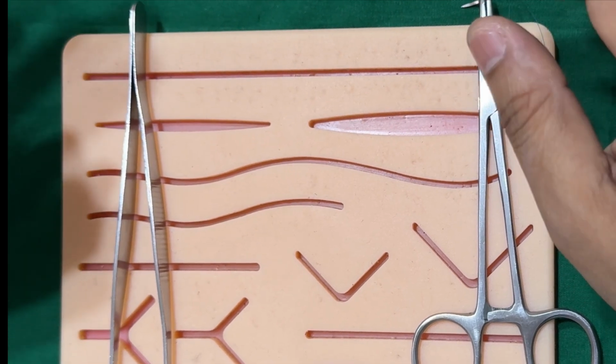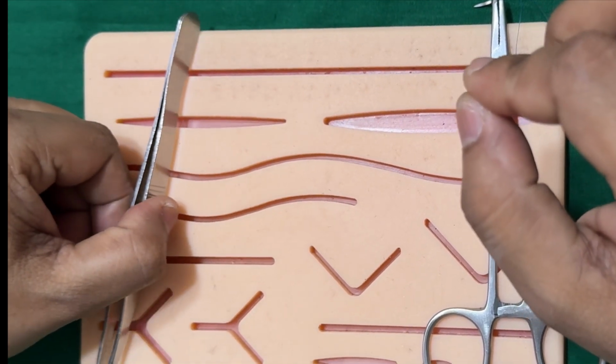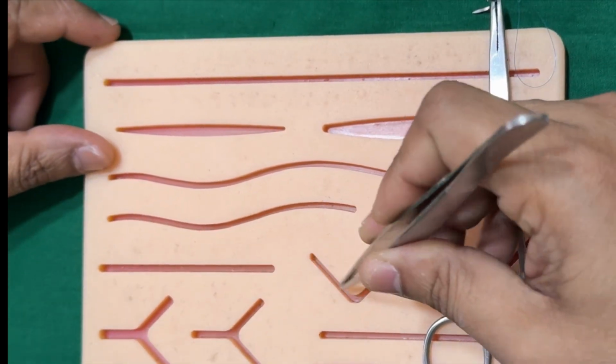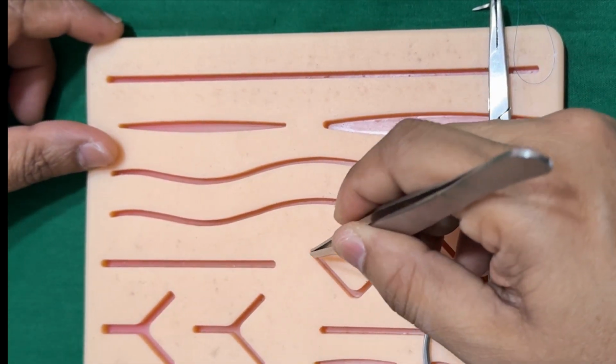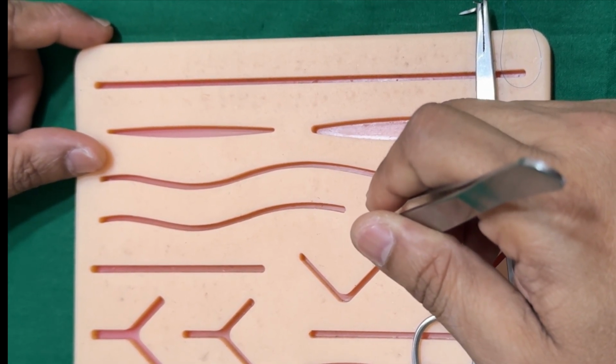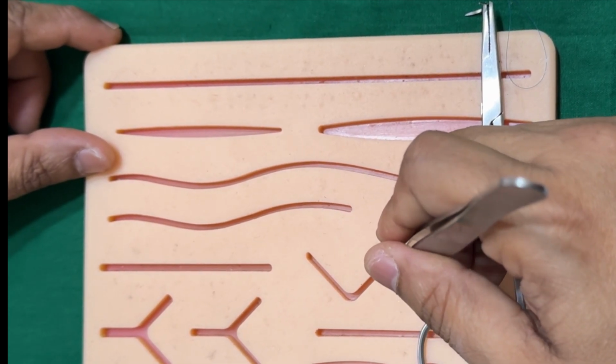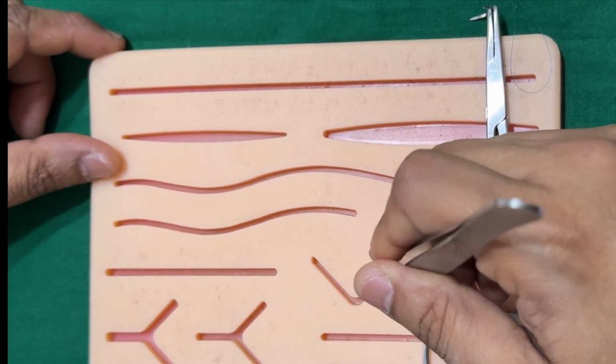Scalpel Artist. Today I'm going to teach you how to do the sutures in a wound which is having an angle, or you can say a corner. Now look here, suppose for example you have a few wounds which have an angle in them, understood? Most probably or mostly we use what is called a horizontal mattress in these cases, right? So that is why it is also called a mattress suture in the angular wound.